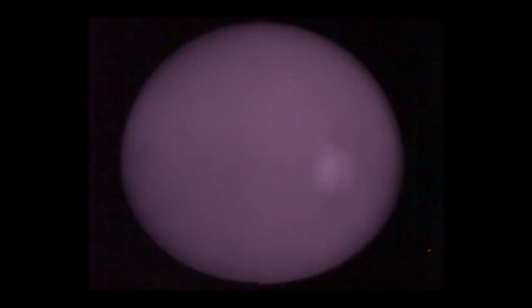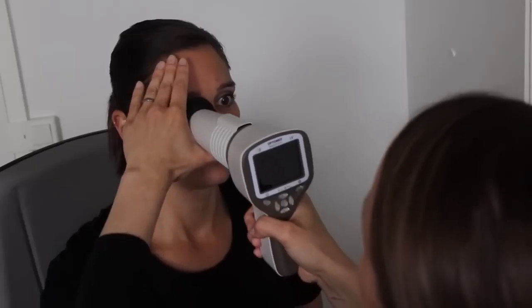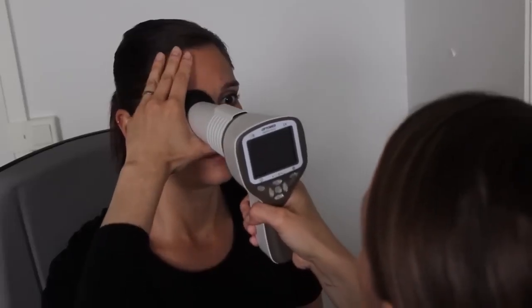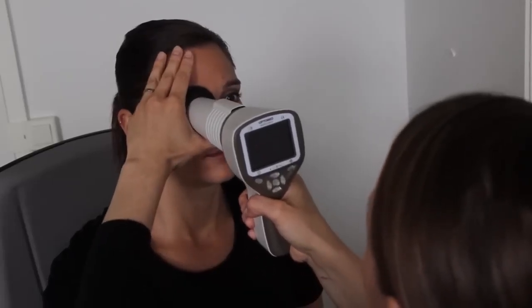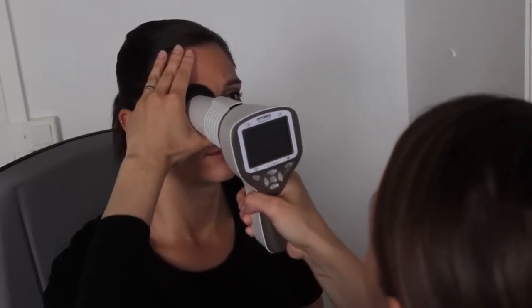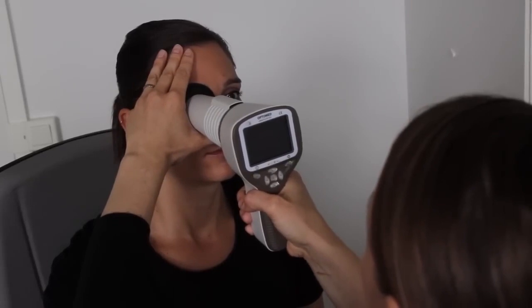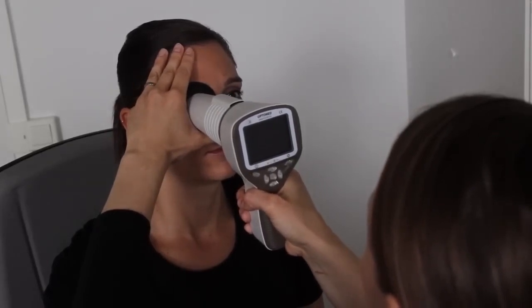If adjustment is needed to recenter on the pupil, it is recommended to adjust the module with the hand supporting the optics module. Only use very small movements as it is easy to lose the target. If the view is lost, just withdraw the camera a few centimeters and realign to the center of the pupil.